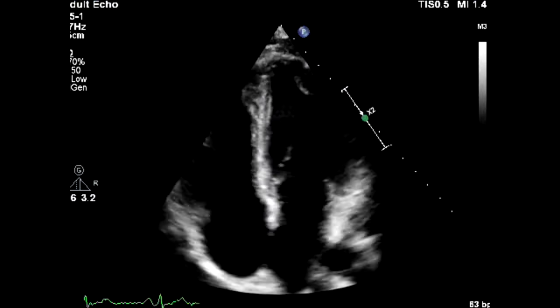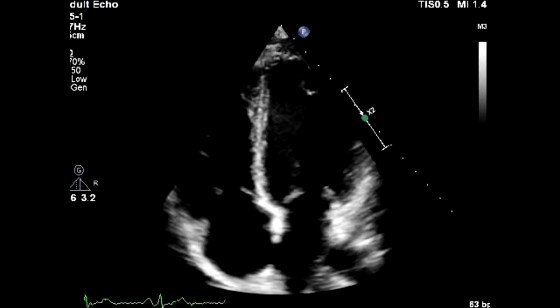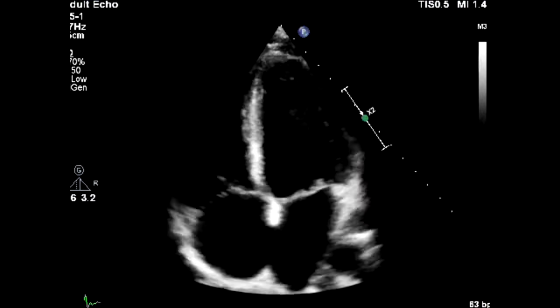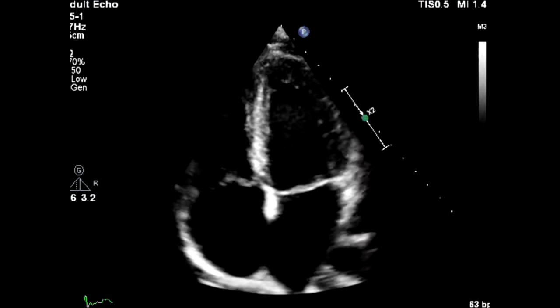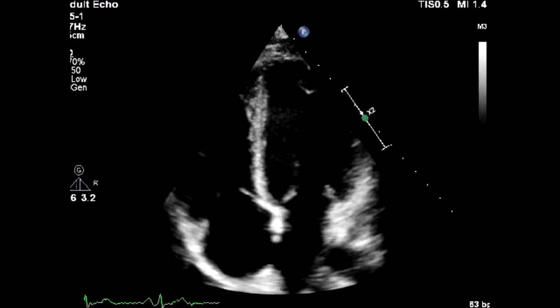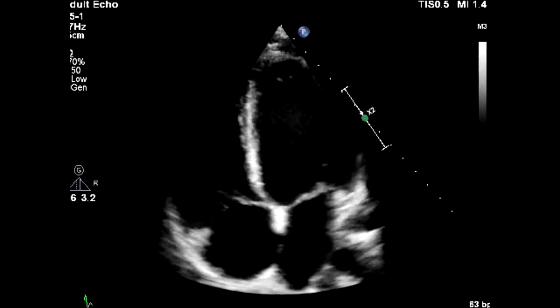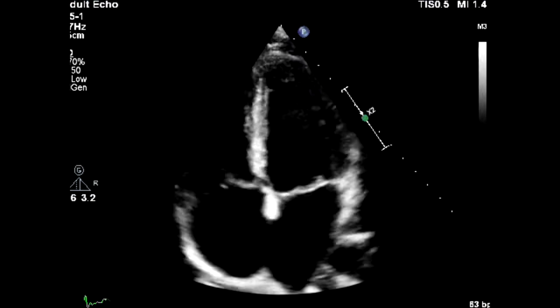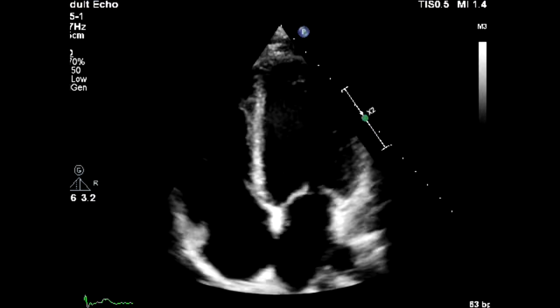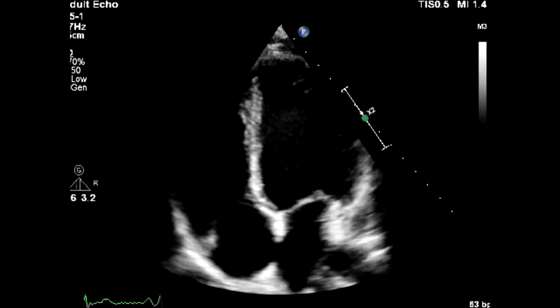The most common reason for referral to echocardiography is left ventricular function. The assessment of left ventricular function is extremely important and the base for many decisions in cardiology. Normally, we judge the left ventricular function by estimating the ejection fraction. When the function of the heart is impaired, the ejection fraction will fall.